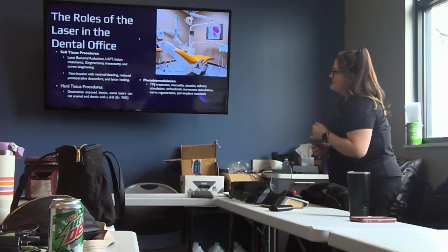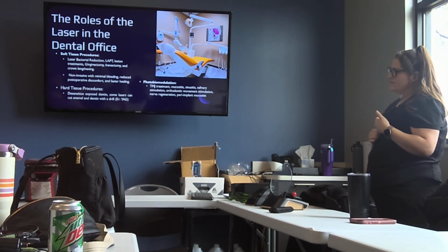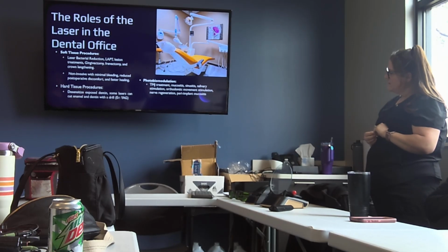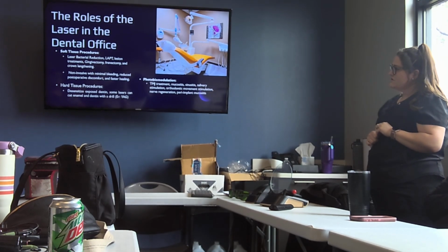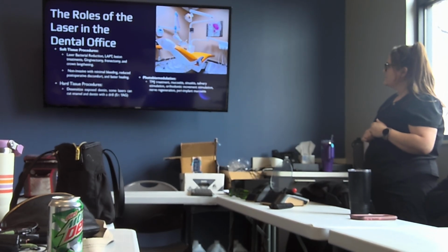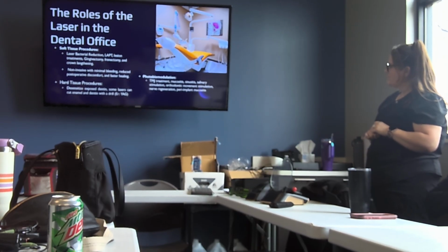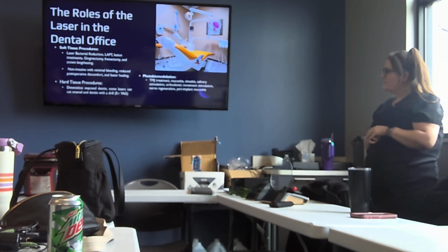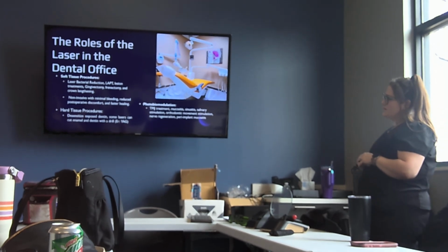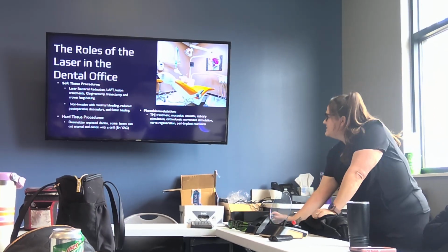So the roles of the laser in the dental office. For soft tissue procedures, there's LBR, laser bacterial reduction, and LAPT, which is laser assisted perio therapy. You can use it for lesion treatments, like cold sores, ulcers, things of that nature, frenectomies, gingivectomies, and even crown lengthening. The benefit is it's non-invasive with minimal bleeding. It reduces post-operative discomfort, like from extractions and such, and promotes faster healing.